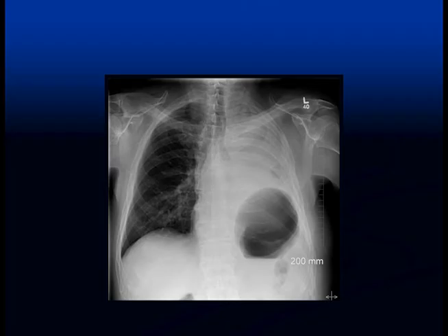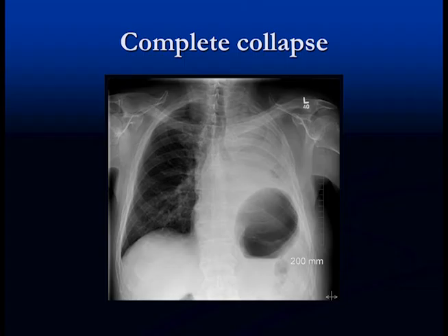Here we've got consolidation involving all that we can see of the left lung, along with evidence of volume loss — tracheal shift and the diaphragm shifted up. This is a complete collapse of the left lung. The main stem bronchus is amputated centrally — it's occluded — and that's what has caused the complete collapse of the left lung.